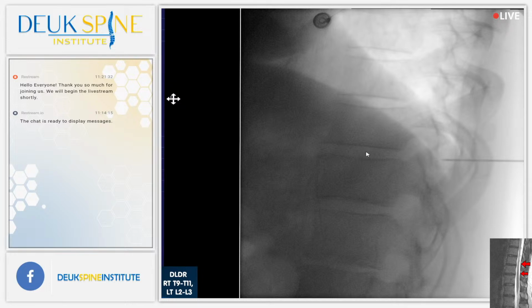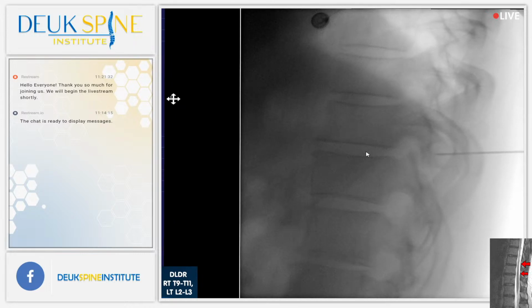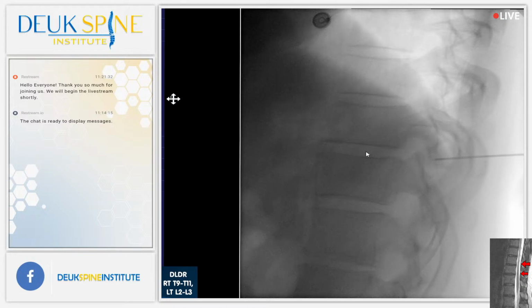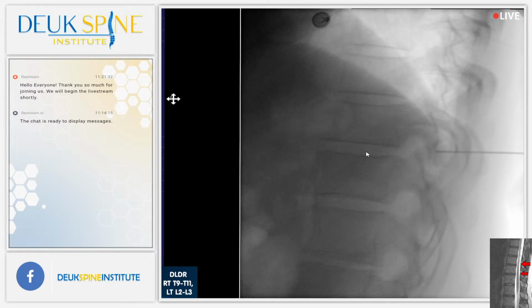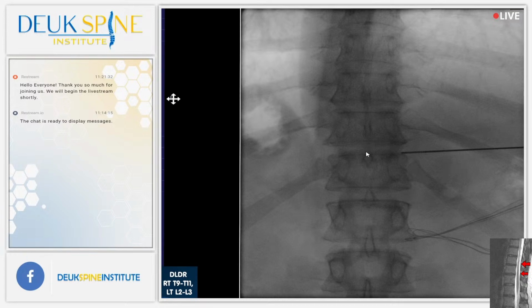I think we're still too medial. And this is really just trial and error shot, going in and figuring out the best trajectory. See, I'm hitting his facets again. I need to get around this facet. Shot. Shot. Let's get another AP view. Lungs are good. Yeah, I'm just a millimeter. See that? We're touching the lateral margin of the facet. I'm so close to getting around it.